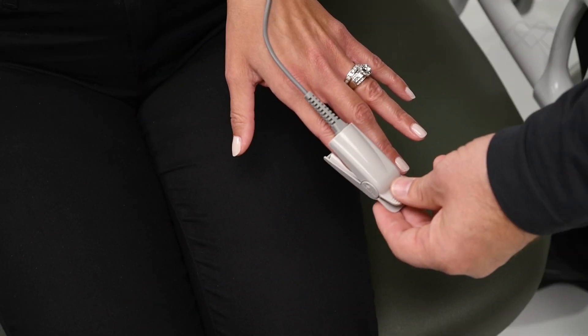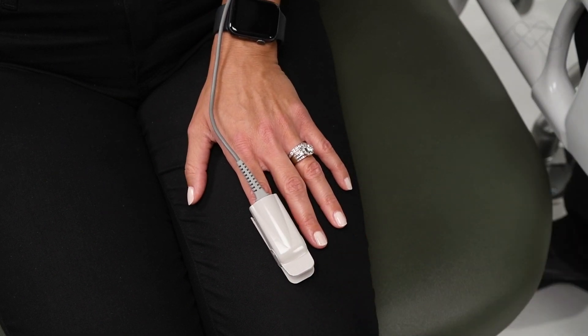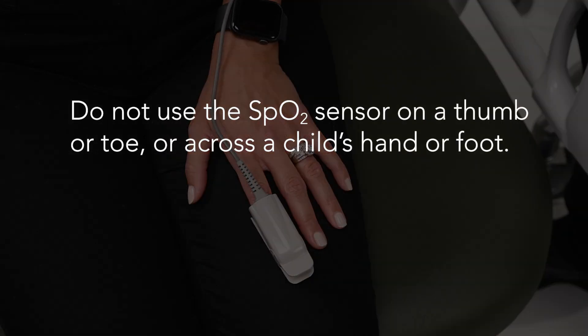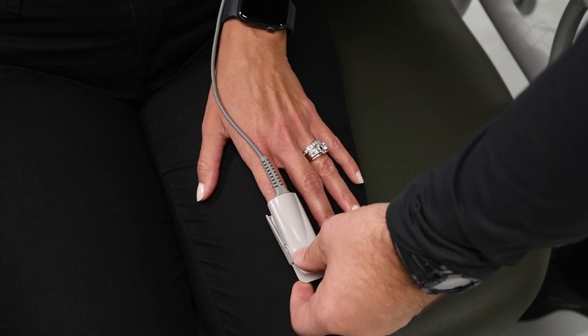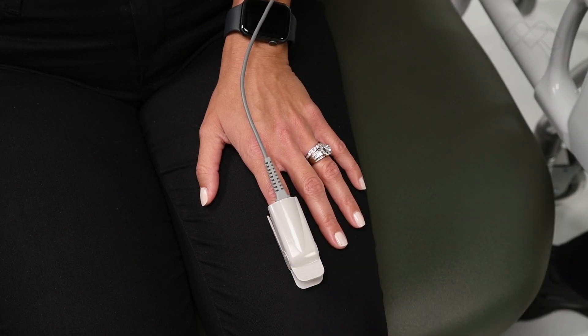Check the position of the sensor. If an index finger cannot be positioned correctly or is not available, a smaller finger can be used. Do not use the SpO2 sensor on a thumb or toe, or across a child's hand or foot. The sensor should be oriented so that the cable is positioned along the top of the hand.